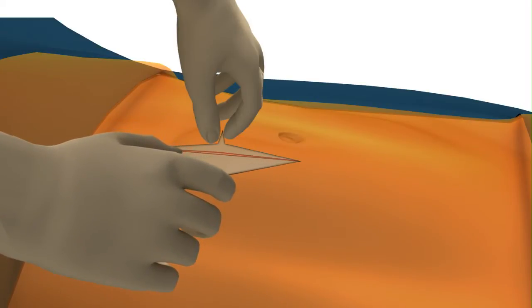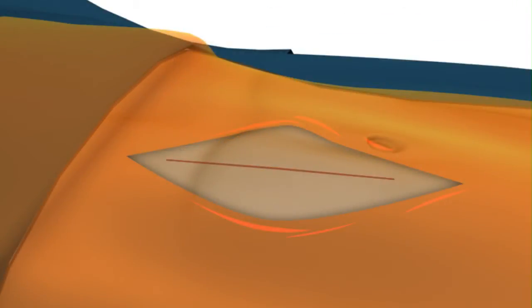Expose up to 1 inch of skin surface along each side of the incision edge and proceed with closing the incision.